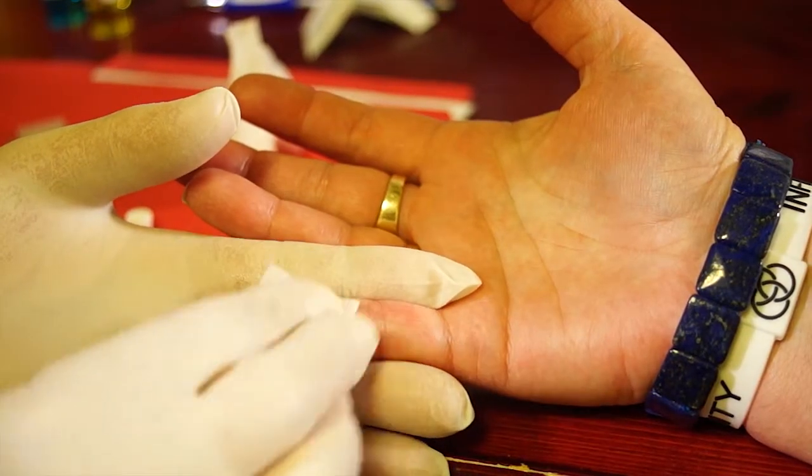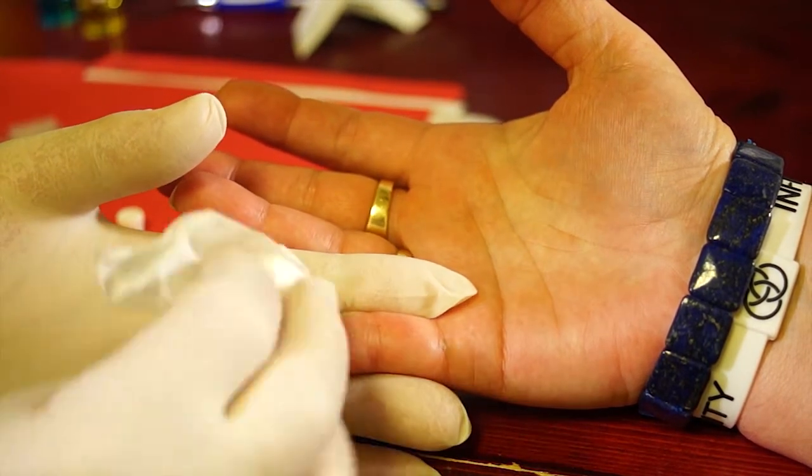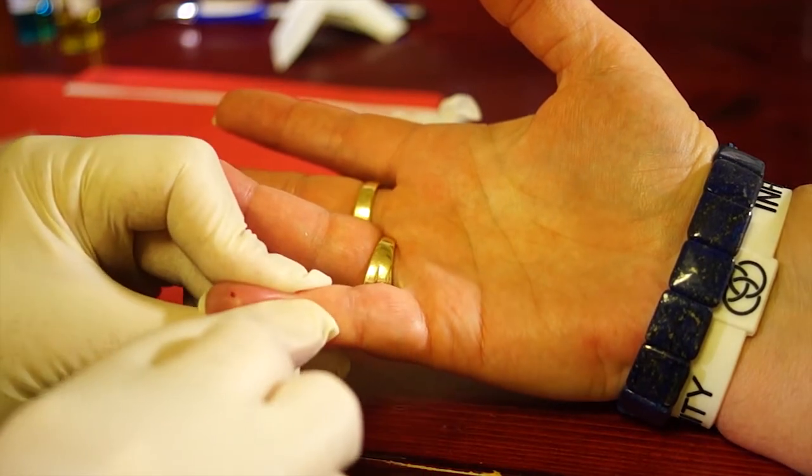We are here today to do Alex Van Waal's blood. We're going to show you a little bit of how the technique is and go on with the live and dried samples. Can I have your right hand here, please, Alex? So we just wipe the finger with an alcohol swab, and we use a tissue that doesn't leave lint. And we just basically give a tiny little pinprick.